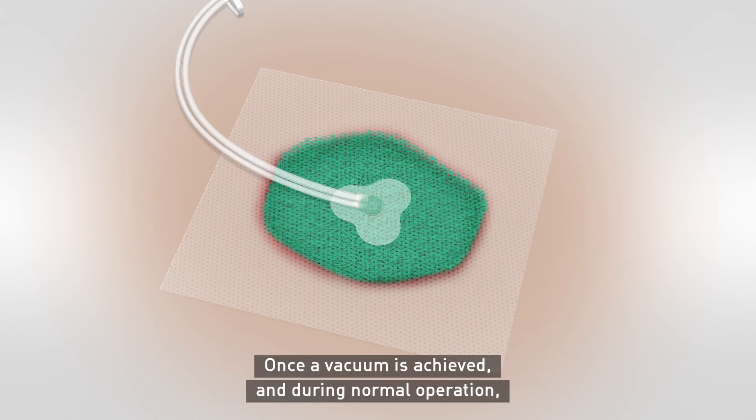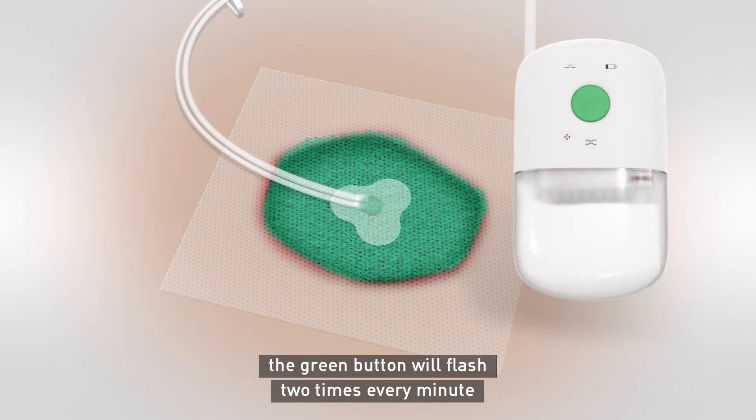Once a vacuum is achieved and during normal operation, the green button will flash two times every minute, indicating the system is working normally.